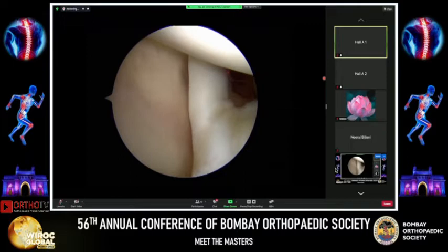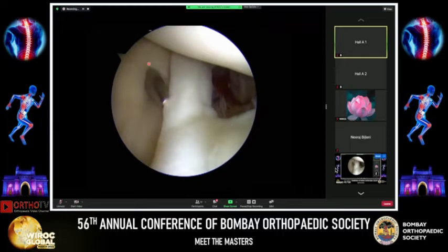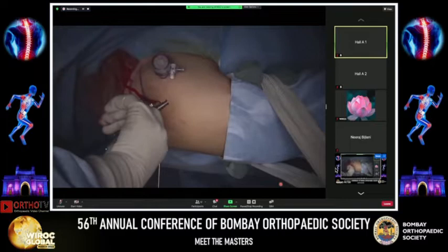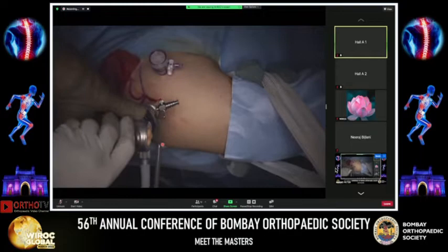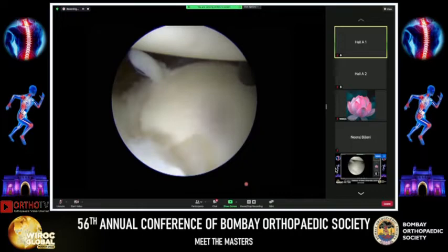I then take the anterosuperior portal, which comes just adjacent to the anterolateral angle of the acromion, entering within the rotator interval itself, just anterior to the supraspinatus. As noted from the Wissinger rod, this portal allows access both anterior and posterior to the biceps tendon. I shift the scope to the anterosuperior portal — now my viewing portal — with the anterior and posterior as working portals. A smooth 5.5 mm cannula is placed in the posterior portal.